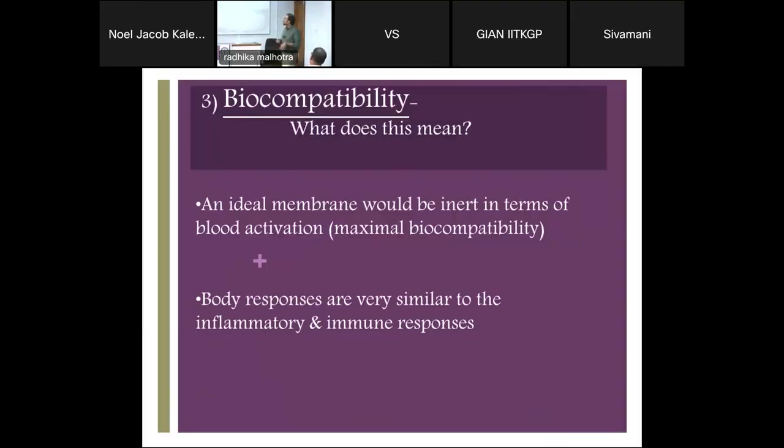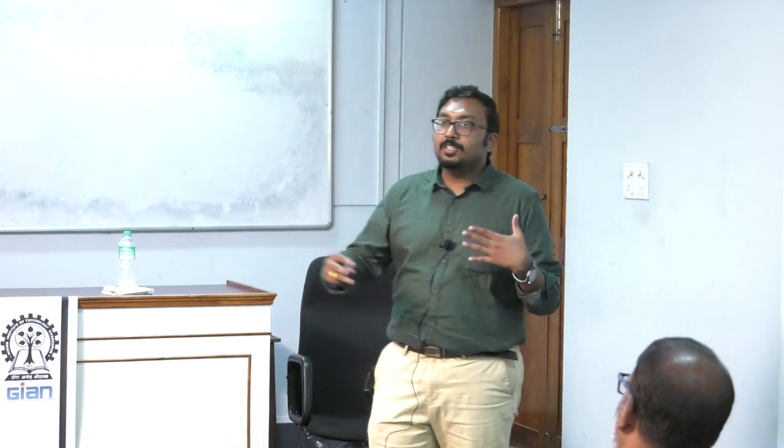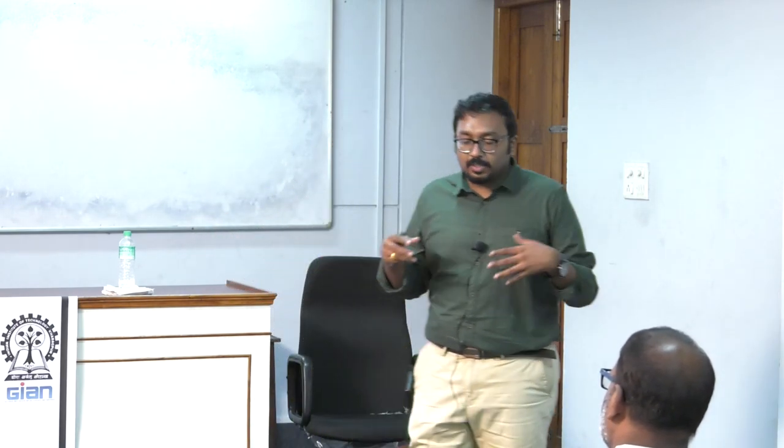Okay. So biocompatibility, in some literature referred to as hemocompatibility or blood compatibility, means your membrane has to be inert to activation, basically any kind of activation. These biological systems are like a cascade of activation series. Protein adsorption is the first step, then comes fibrinogen, so it forms a clot, and it can activate complements. Once complement activation is very severe, it can even lead to death of the patient. So your membrane should be inert, it should not trigger any of the cascades that occur in blood.